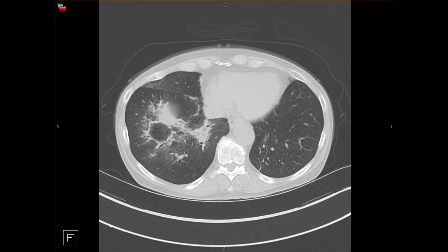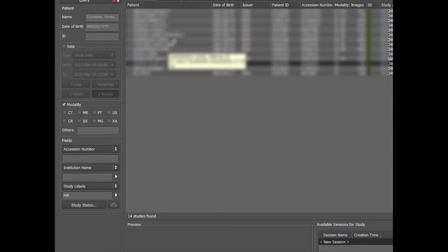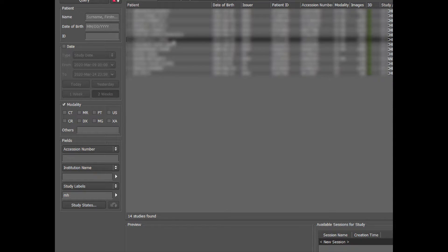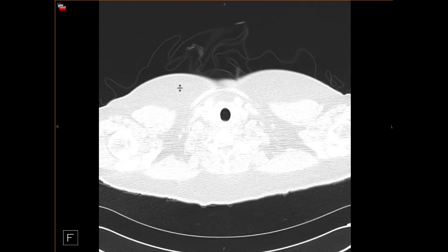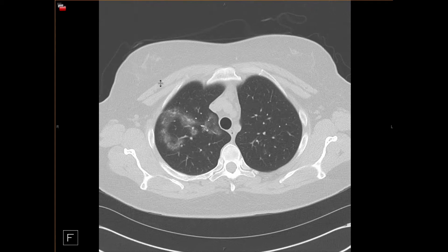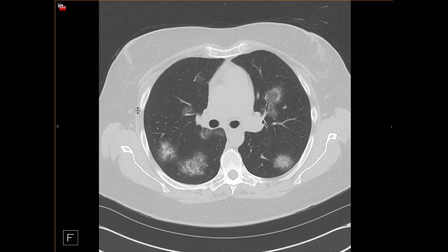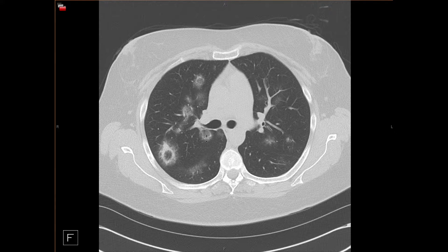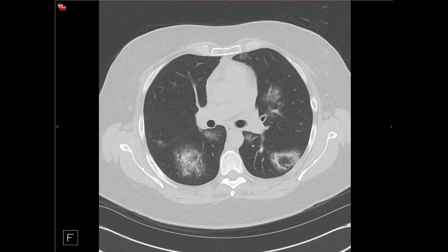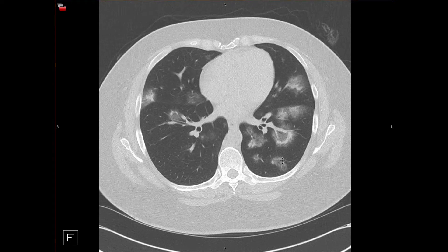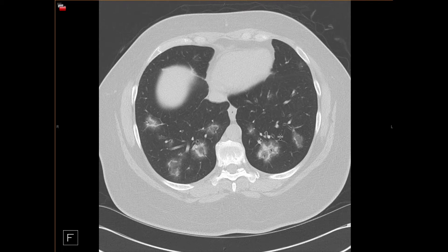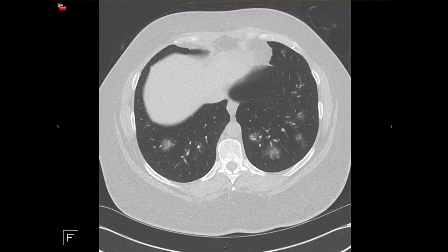In organizing pneumonia, the opacities tend to be either peripheral or peribronchovascular. The reverse halo sign is not necessarily present in these cases, but if it is, it can be very helpful for diagnosis. Other inflammatory conditions can also produce the reverse halo sign — here is a patient with vasculitis, specifically granulomatosis with polyangiitis (formerly Wegener's), presenting with the reverse halo sign. Without a known history, you would probably think this was organizing pneumonia, but it turned out to be vasculitis.